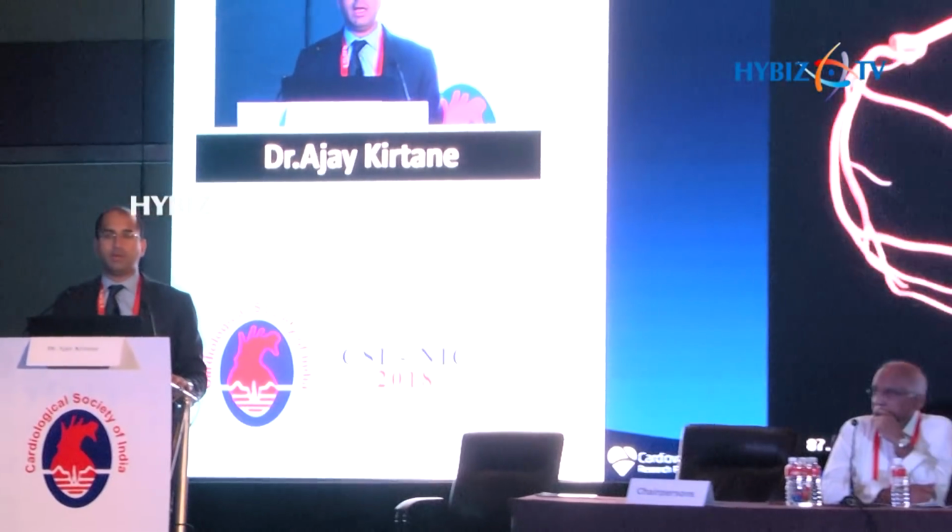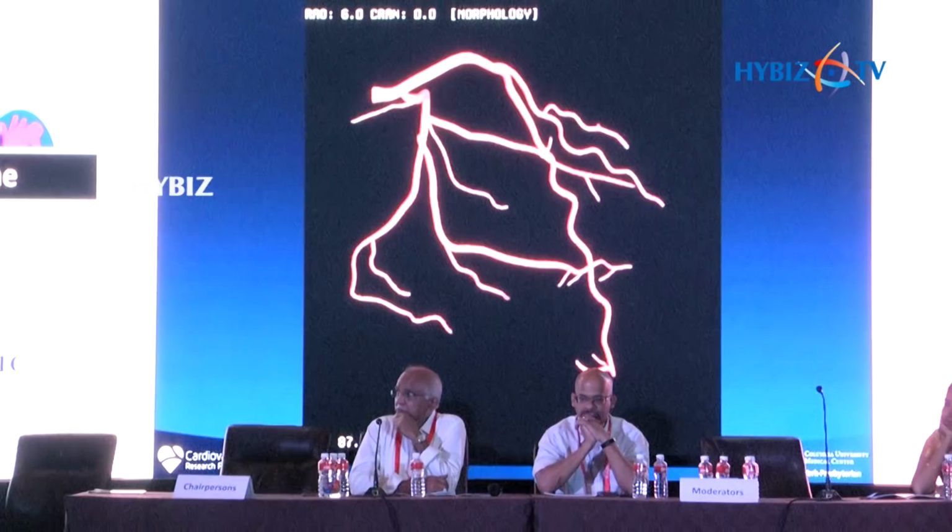Why angiography is an art, though, is because of this. It's a three-dimensional structure that moves, and we're trying to project it in two views. So this is a video that looks at all the different views, but you can appreciate how the anatomy and everything about these views change based upon the time we're looking at it and how we're looking at it, and that's why you have to be very good at being a good angiographer.